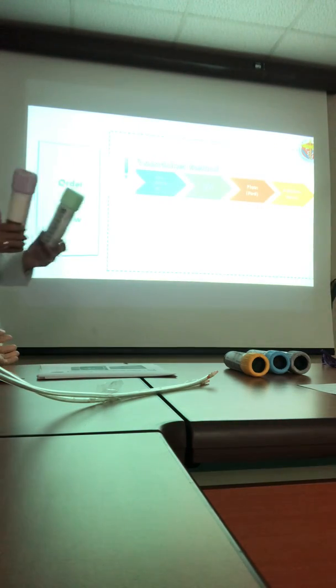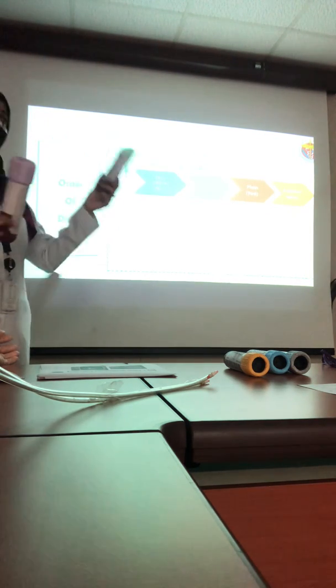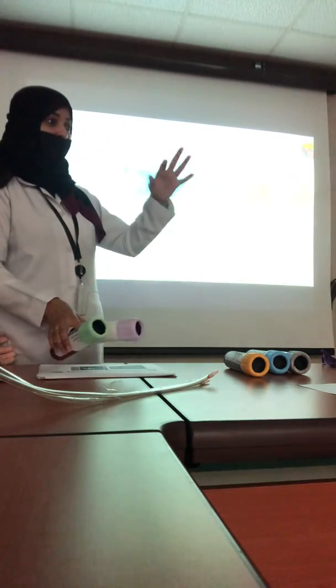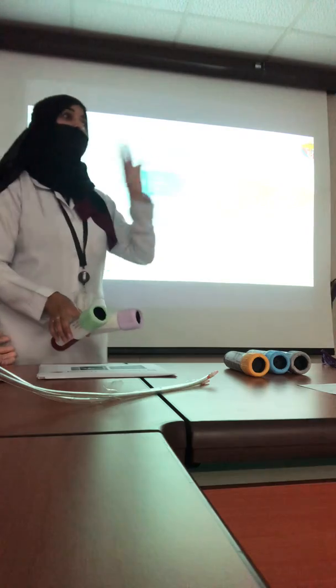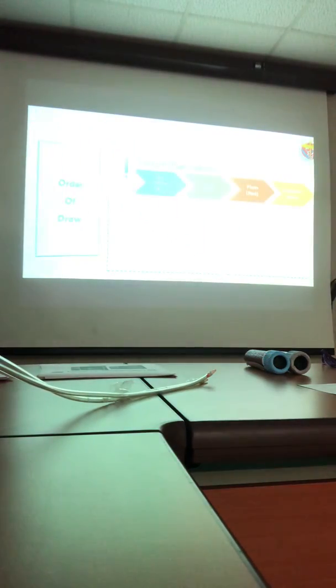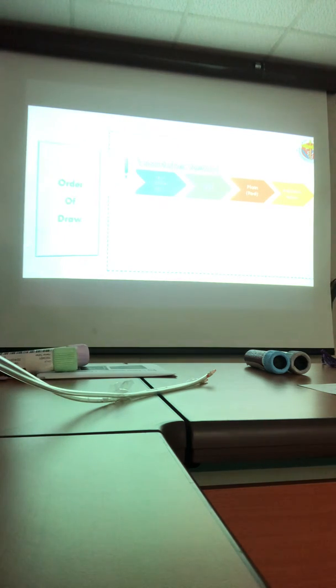You don't know. Okay, I have two types of tubes: non-additive tube and additive tube. The non-additive tube means plain tube. The blood inside the tube is similar to the blood inside the vein. This is the first tube I should extract. But actually we don't have the plain tube. This one, the yellow top tube, which we call the plain tube, contains clot activators to accelerate the clotting. So logically we should start with the plain. But I don't have a plain tube.